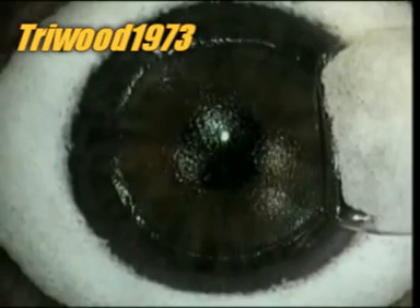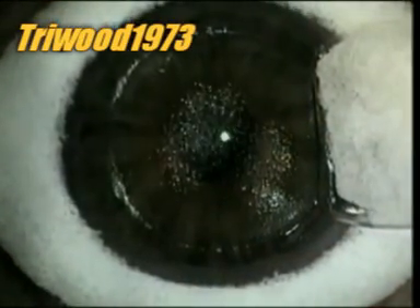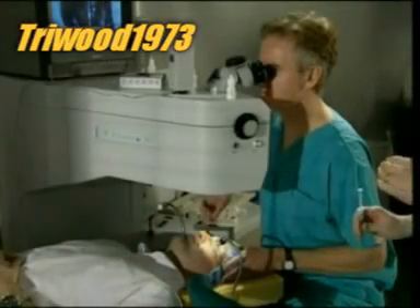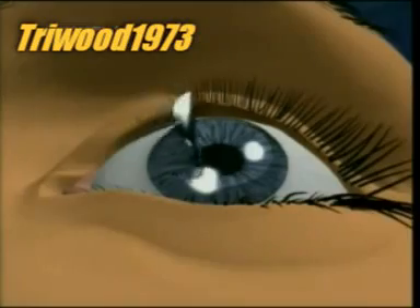The laser, an invisible beam of light, fires in 50 pulses per second. Each pulse vaporizes a one-quarter micron of corneal tissue. The laser is controlled by a computer program, so it knows exactly how to reshape the cornea to give most patients 20-20 vision. In less than a minute, the laser has done its job.